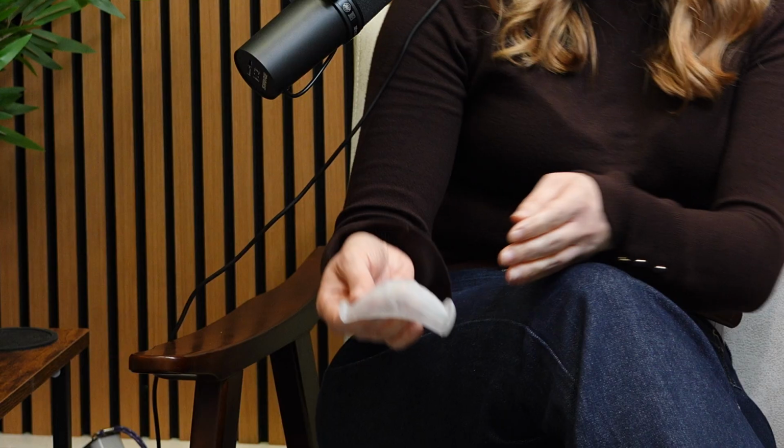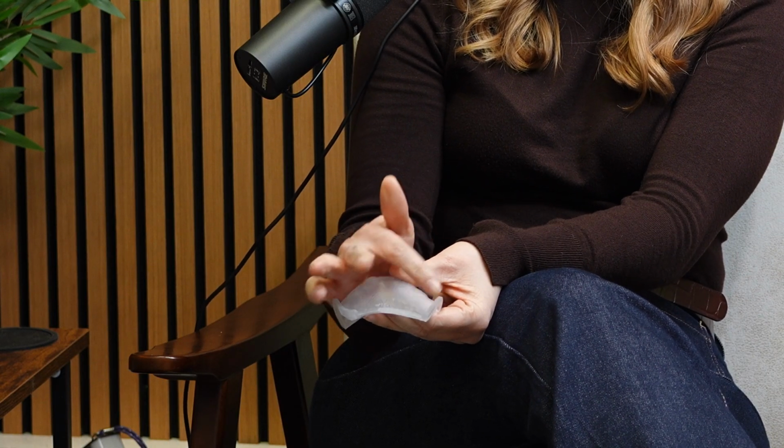Could you tell us a bit about the design of the guides? So for the DCIA, the pelvis, we normally provide 2 cutting guides. There's an initial guide for when they are just removing the pelvis bone that we want from the actual pelvis. This guide is quite restricted with access, so they can't shape the actual orbital floor in the area for the nasal cavity whilst cutting with that guide. That guide's purpose is just to cut out a block of bone from the pelvis, which is roughly the right size that they can then shape further down the line. So that's the initial guide, which often looks like this. They would just put it on and cut out a straight block.